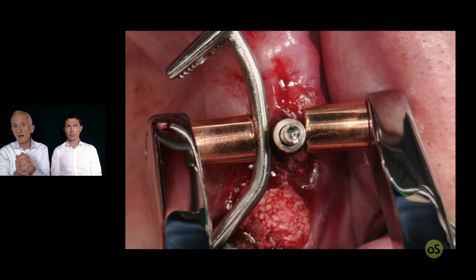You still have to weld. Before you start welding, you zoom out and look if the wire is more or less in the position that it had at the beginning of the procedure. It might be that once you release the clamp, the wire is dislocated somewhere, somehow. So you have to check that this doesn't happen.